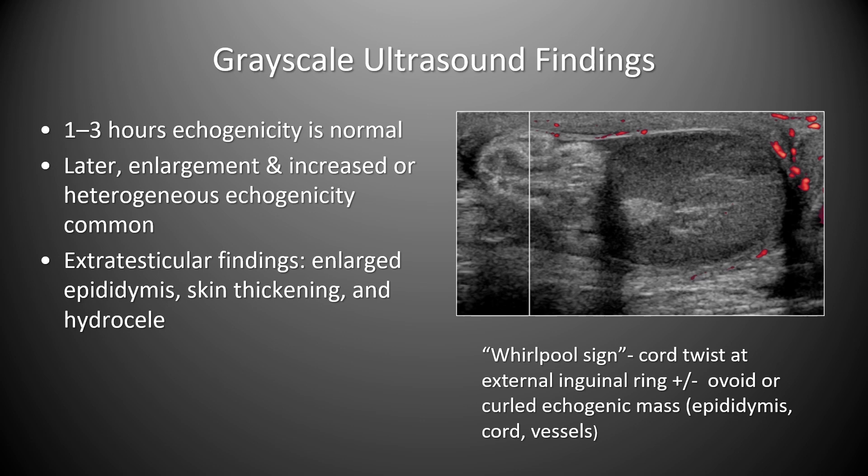The whirlpool sign is the most specific sign of testicular torsion and describes a twisted cord at the external inguinal ring with or without an ovoid curled echogenic mass representing the epididymis, cord, and vessels, as seen in this image. There is no flow within the testis, and there is this curvilinear echogenic mass — the whirlpool sign.